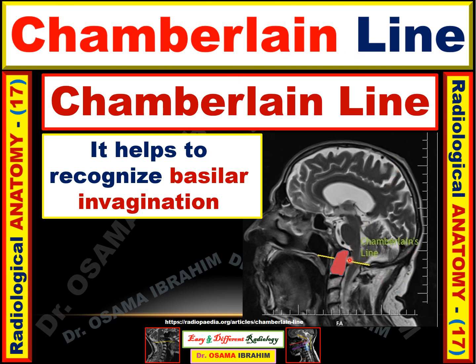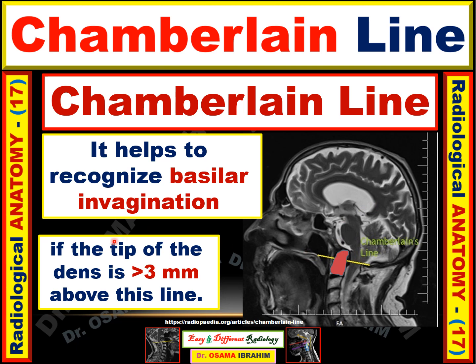And this is the tip, which is colored now, and it can be clearly discriminated and recognized above that line, the Chamberlain line. And there is a landmark, which is 3 millimeters. If the tip of the dens is more than 3 millimeters above that line, consider it a basilar invagination. Normally it is below the line. However, if it is above, you should measure it in millimeters to be more accurate in diagnosing basilar invagination.